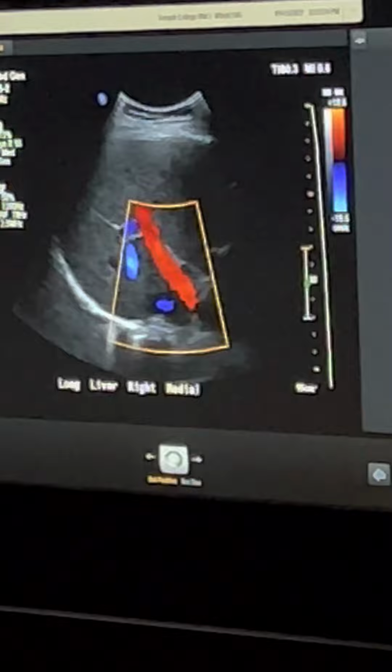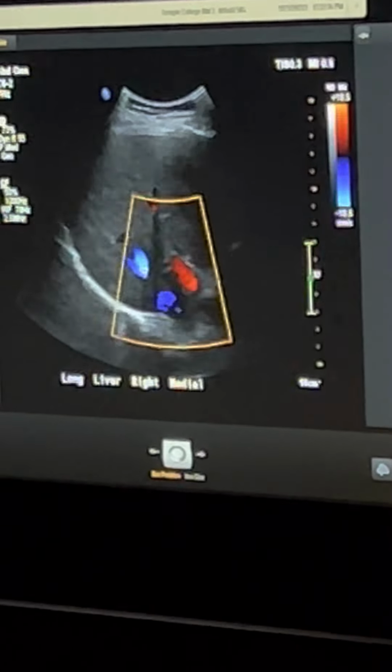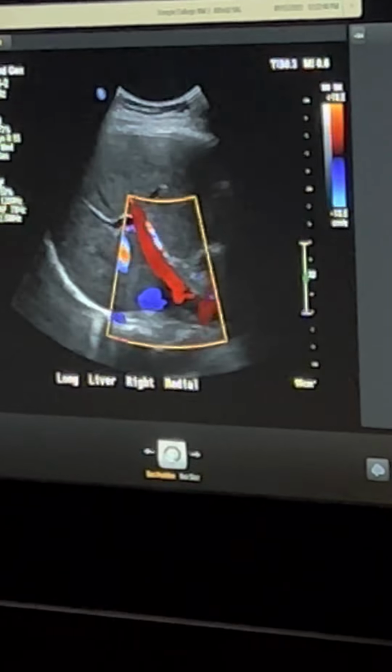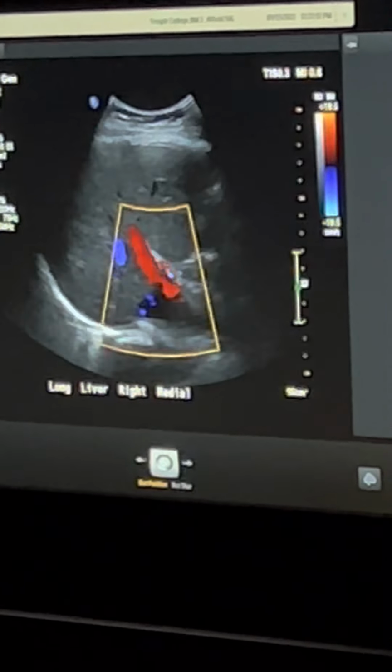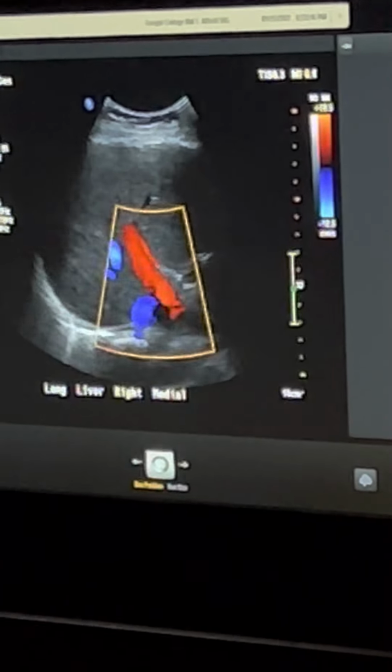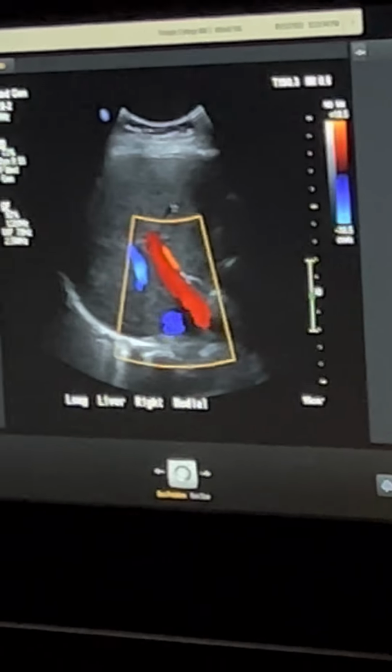We know that they're measuring it. Are they measuring it? No. No, I mean the diameter. Do we have a measure in the diameter? Just color, pulse wave, regular. Nothing in 2D. That might be on the abdominal Doppler. It does say 2D, color, pulse wave. I don't think they measure it. No, I think they do it on the abdominal Doppler protocol though.